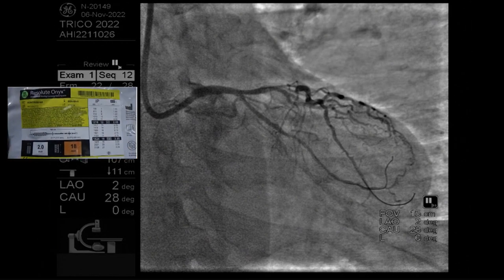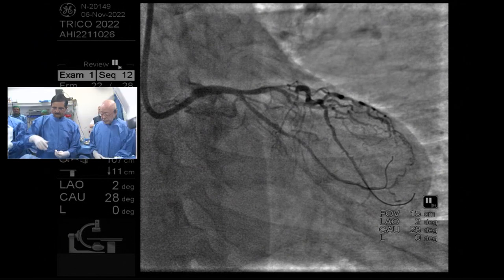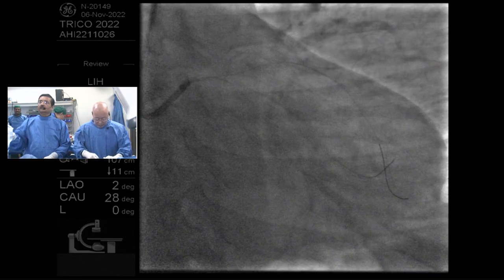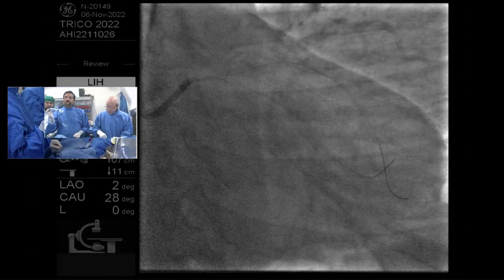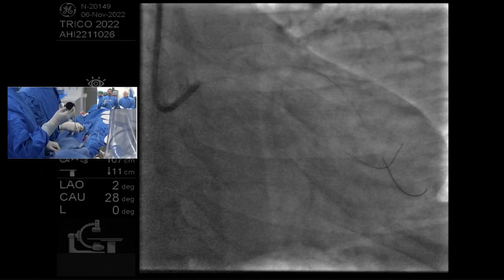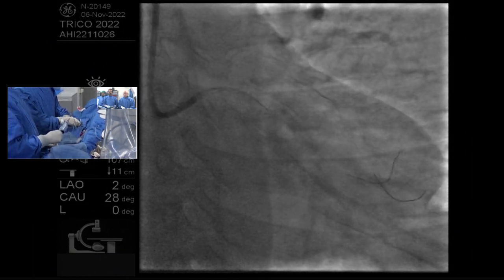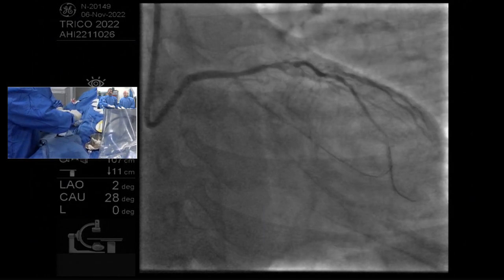It's not a long lesion, it's a short lesion, calcified, so you could also think of doing a DCB in that lesion. The challenge that I have with that is that if you look at the ostium of the circ, it almost looks like it cones out. So my question is, how do we know that that's not diffuse disease? And if it is diffuse disease, do we DCB across the lesion, or do we carpet bomb the circ with a long stent that you can then take up to an EEL to EEL size that actually approximates the true size of the vessel? I think that's where we all seem to be struggling, right?